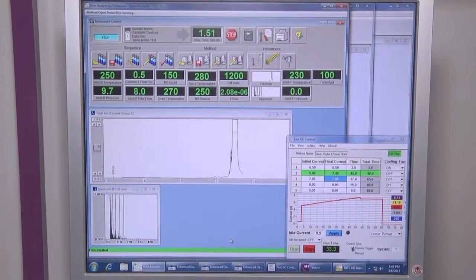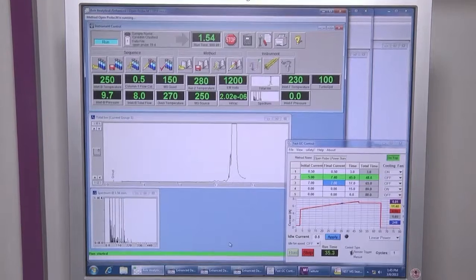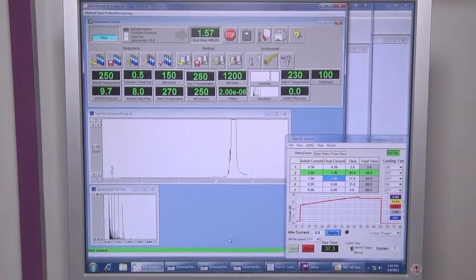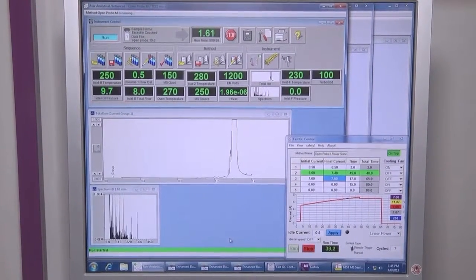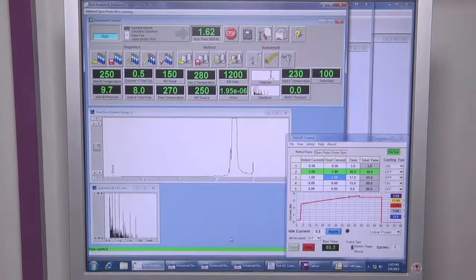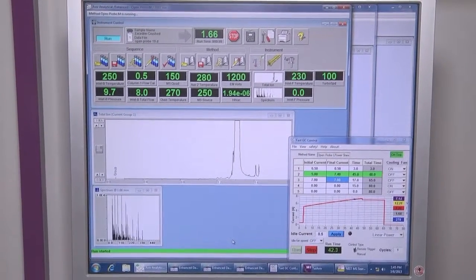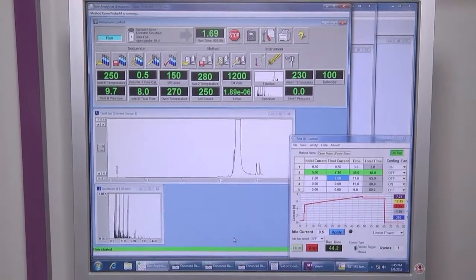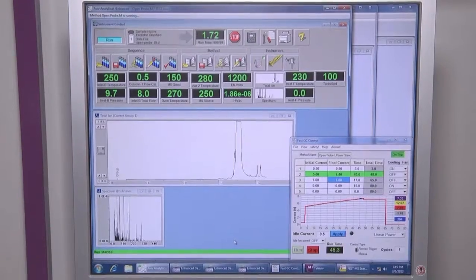Soon we shall have the peak of 6-monoacetylmorphine. Here it comes, and then we will have heroin, which just now came out and eluted.